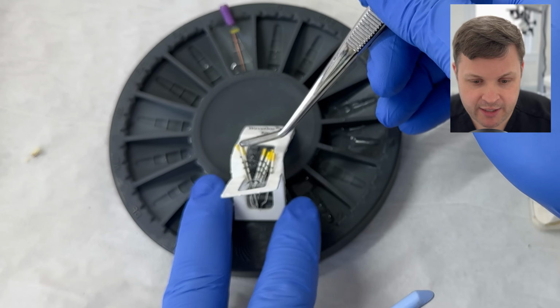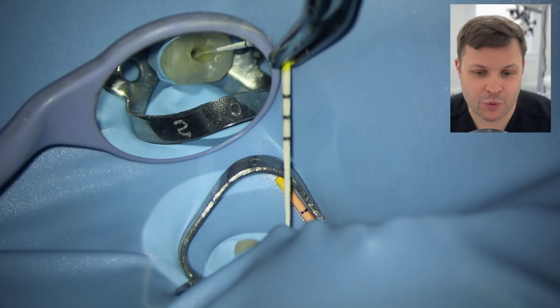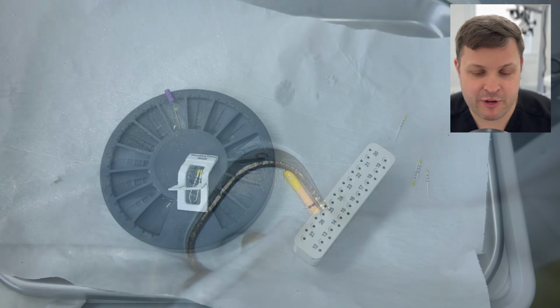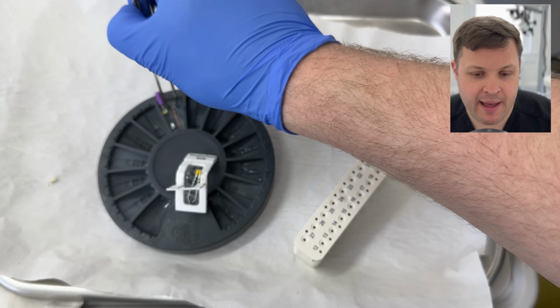We're ready to do our final drying. I'm using these Wave One Gold paper points. I'm not too worried that they're a different taper and not going to get to length because I know they're drying. And then we're ready to prepare our GP cone.